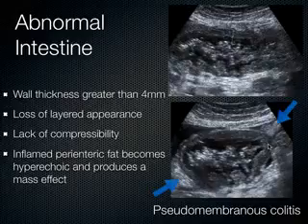Not unlike the way patients with cellulitis, with skin infections, you see all these hyperechoic islands that you're going to learn about pretty soon that we call cobblestoning. And so anywhere in the body with ultrasound, whenever there's inflammation, it appears as hyperechoic areas. That's how inflamed tissue looks.